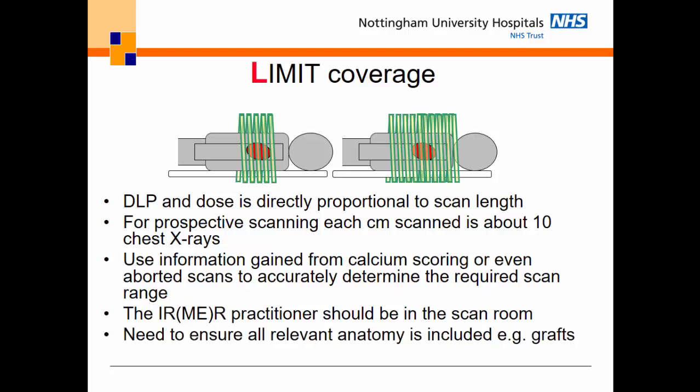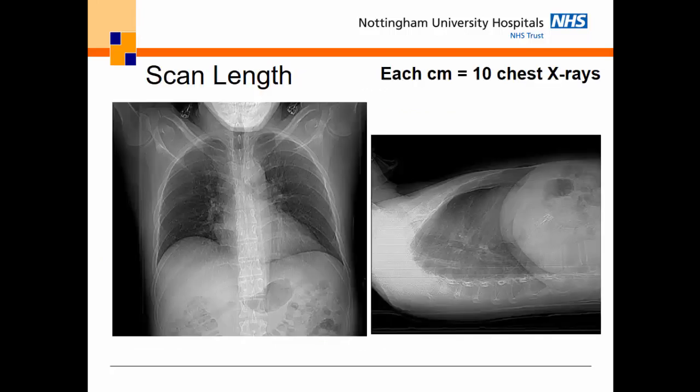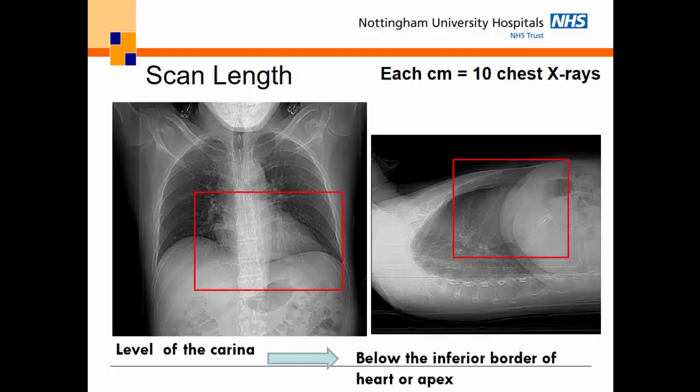You obviously need to make sure all the relevant anatomy is included. We don't want to miss anything off. Okay, so just to show you the scan range that we think you should cover, and a reminder that every centimetre extra is 10 more chest x-rays.